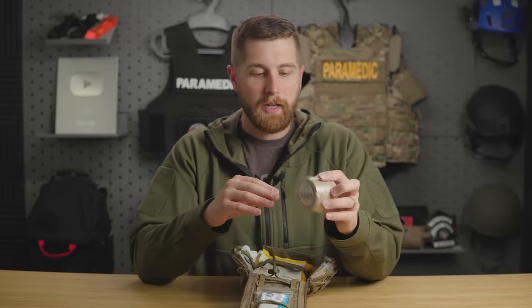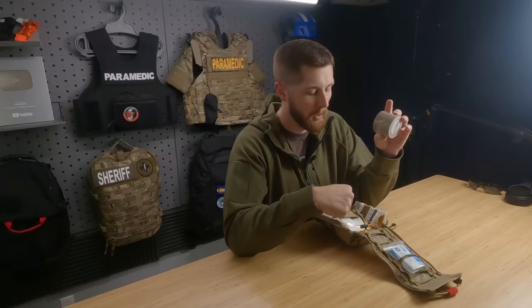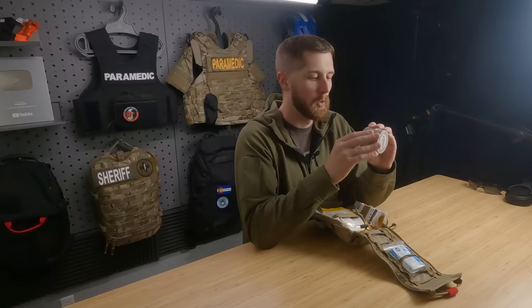Now I will say that this isn't the most compact form factor of tape. I know there are a couple tape brands out there, or you can even take duct tape and put it on a credit card. This takes up a little bit of space. If you're not going to alter this loadout at all, I think this tape is great. It fits fine. But if you wanted to add more in here or make the kit a little bit lighter, I'd say this is something that I'd lose, or at least make this a little bit more compact by wrapping this around a credit card, something like that.